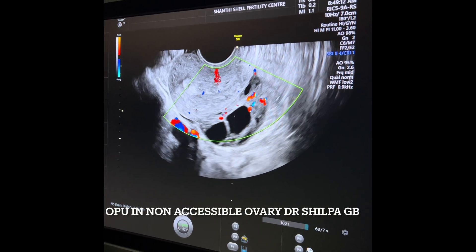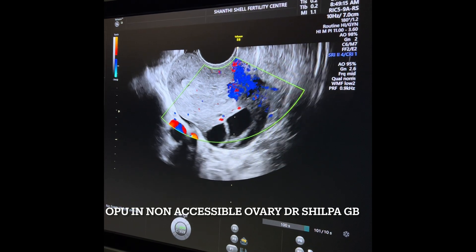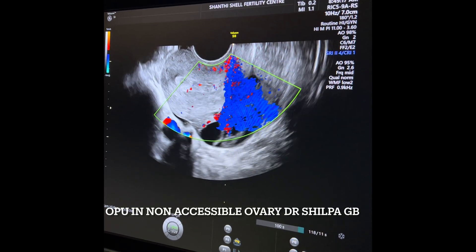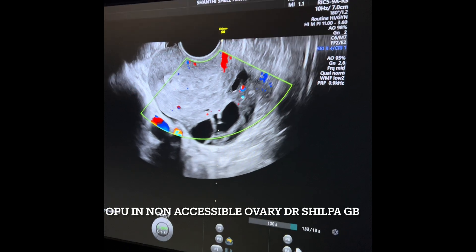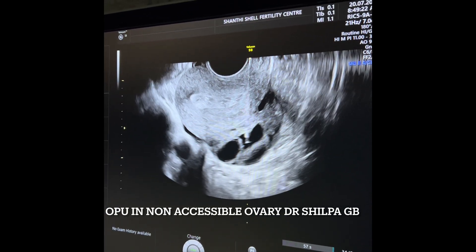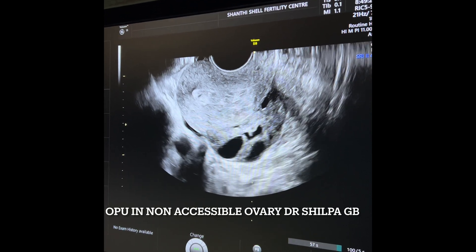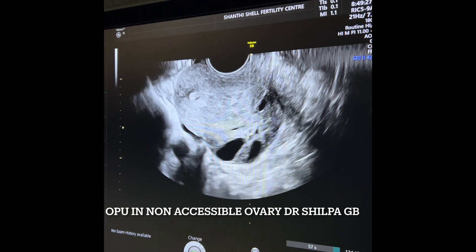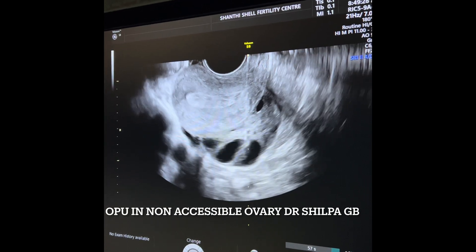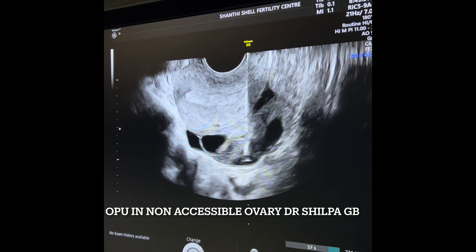This is an OPU procedure. I have finished one side of the ovary — the right side — which was accessible. You can see that the uterus is in between the ovary and the vagina, and I have entered through and through the uterus. The needle — you can see the complete length — and I am in the follicle where I am aspirating. I will go to the next follicle with the same prick and aspirate that follicle also.